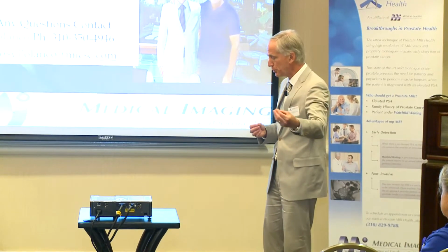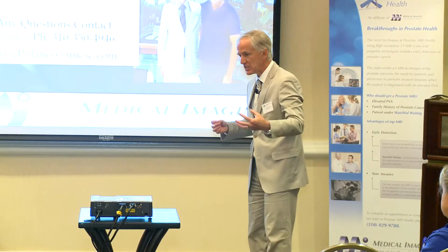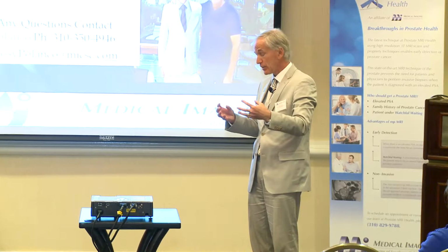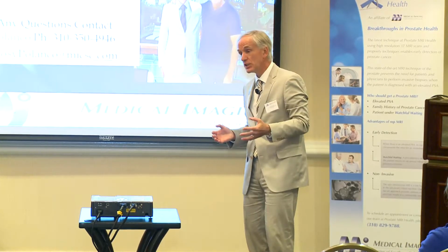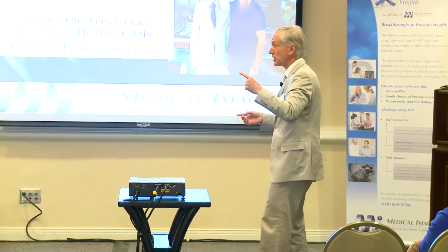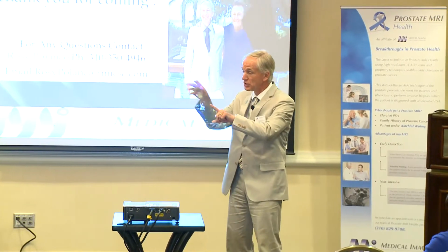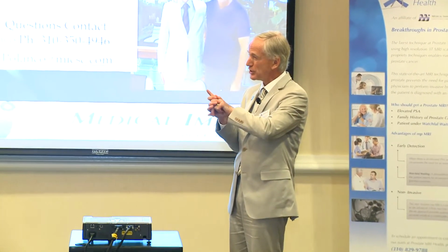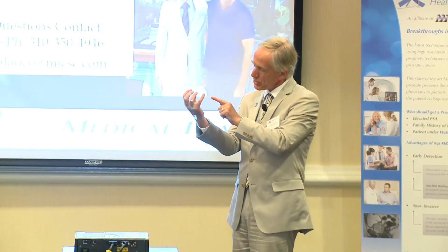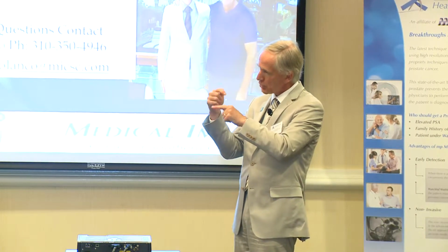You may see enhancement in BPH, benign prostatic hyperplasia. You may see enhancement in prostatitis. You may see it in cancer. So with power and color Doppler and contrast enhanced Doppler, it will be the same. Elastography is just the urologist's finger with a sophisticated technique. You feel the prostate and you feel whether there's a stiff area. You see whether there's a stiff area. It depends on the pressure which you are applying with the probe, what the signal is which comes back. So if you press, a lot of signal comes back, so that makes it operator dependent.